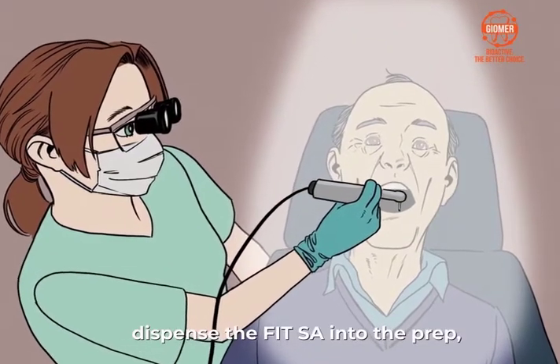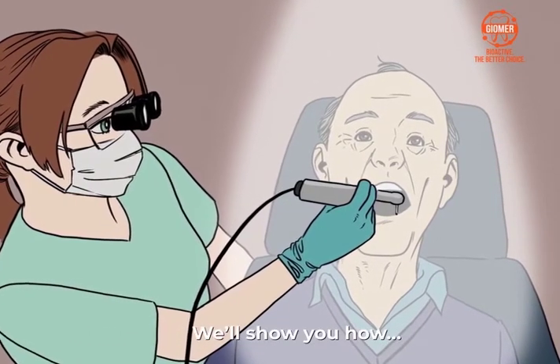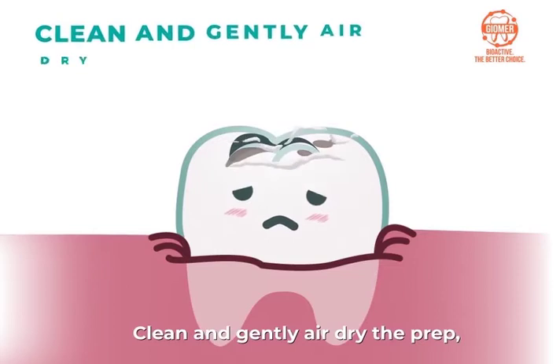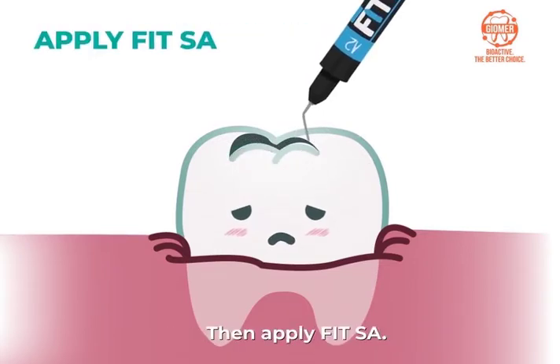Simply prepare the tooth, dispense the FitSA into the prep, and light cure. It's just that easy. We'll show you how. For PRR and small class 1 restorations using low flow F03 viscosity, clean and gently air dry the prep, leaving it slightly moist. Then apply FitSA.